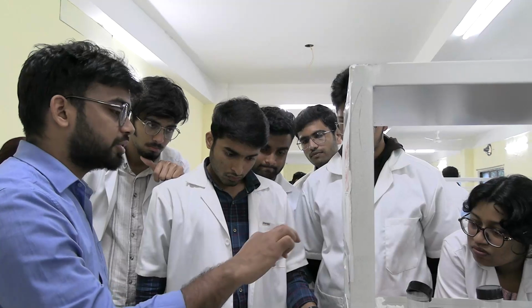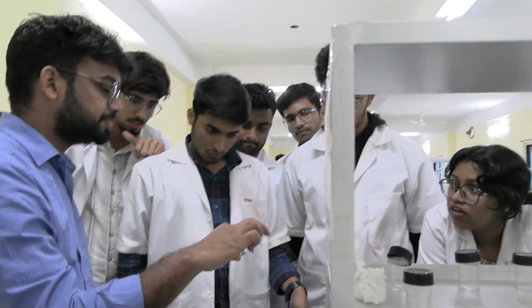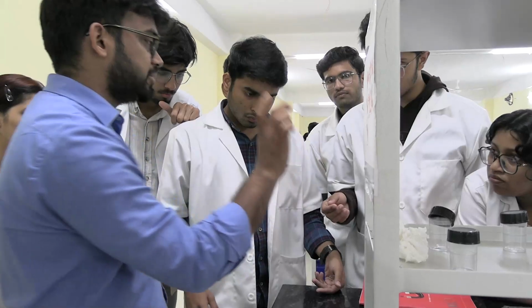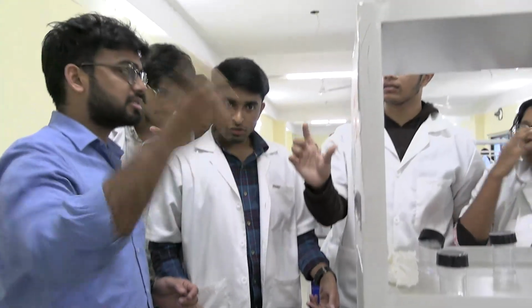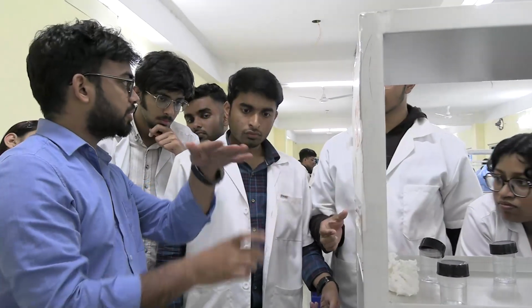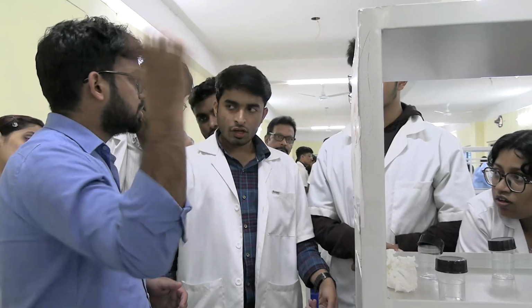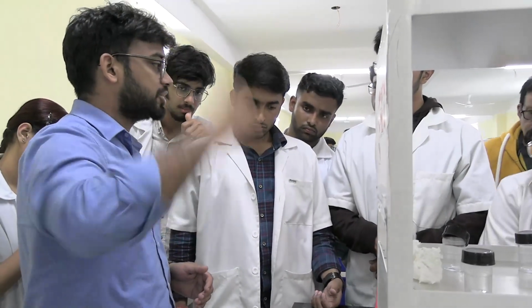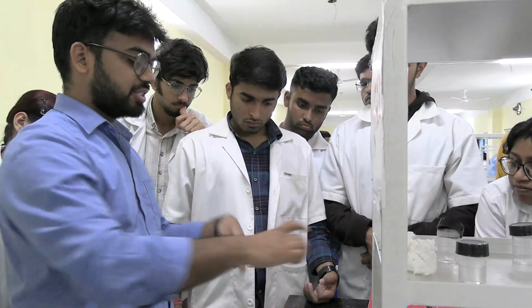So now what are we going to do? Next step: air dry. How will you do it? Like this. Remember this is the upper part. I am going to air dry it for 2 minutes, till it becomes dry. So this is the difference. Good.